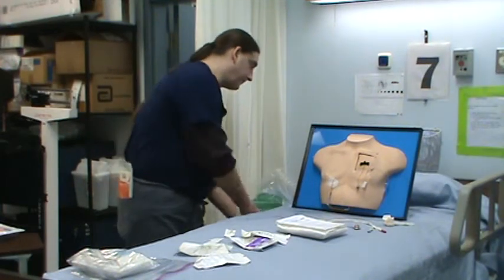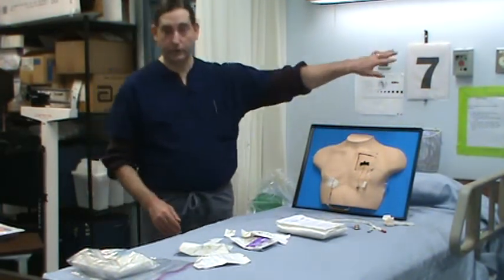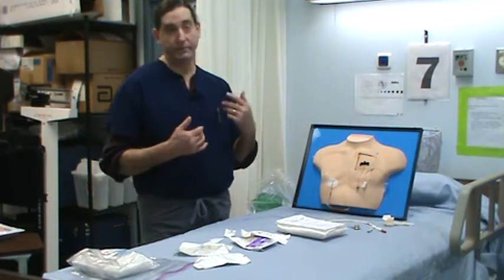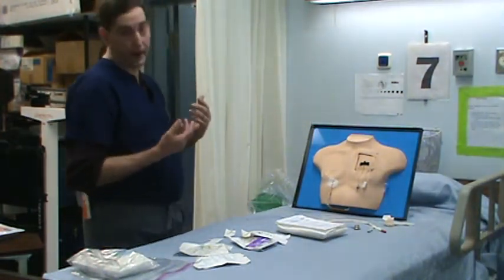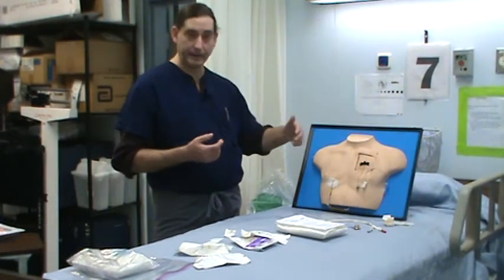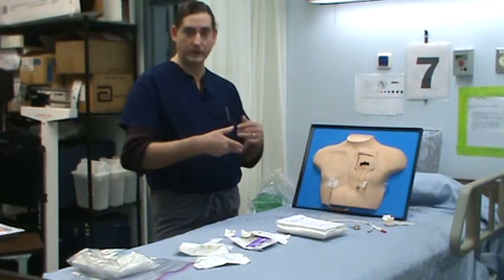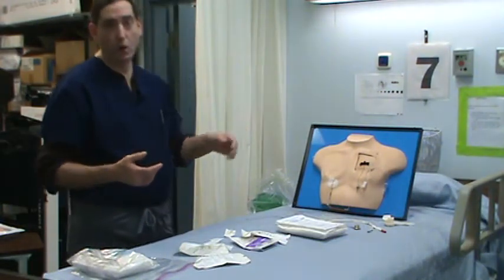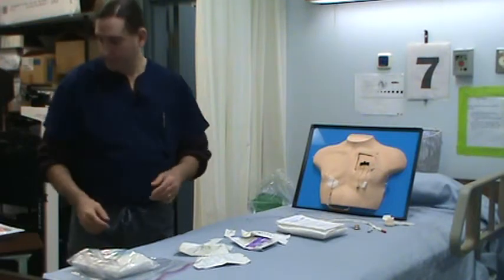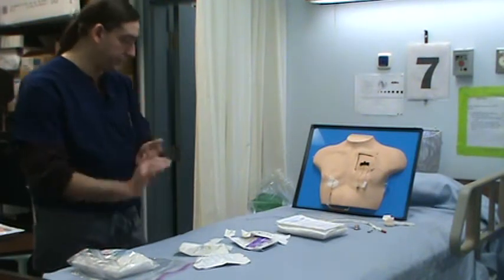If a patient can turn their head, I'm going to ask them to turn their head away, because I don't want them breathing germs down into it. But sometimes people have neck surgery, or maybe they're contractured a certain way. I have had a person with his head contractured to the same side. Well, I put a mask on him, because I don't want his germs blowing down. When you're breathing, germs are coming down at a 45-degree angle. So we are now going to get started with our central line dressing.